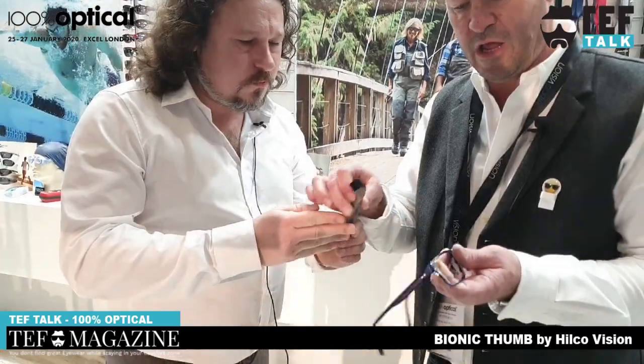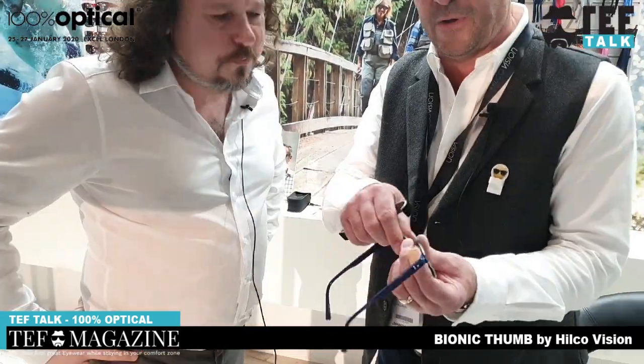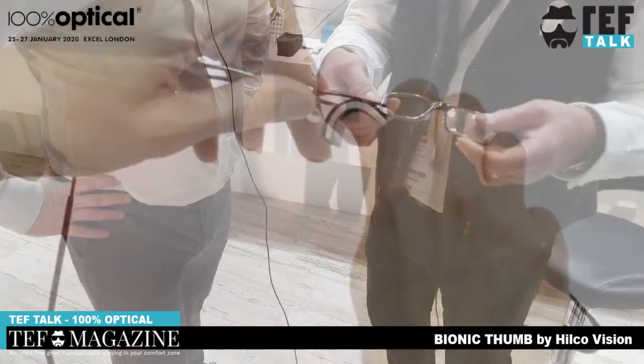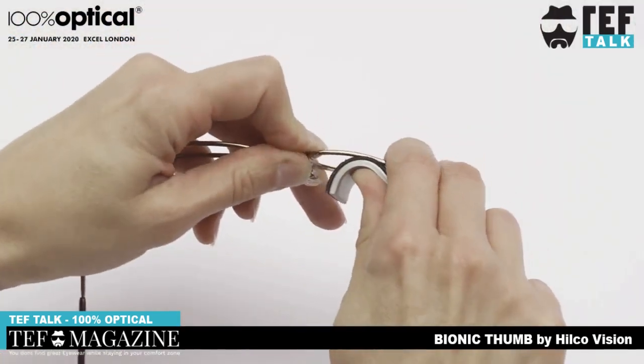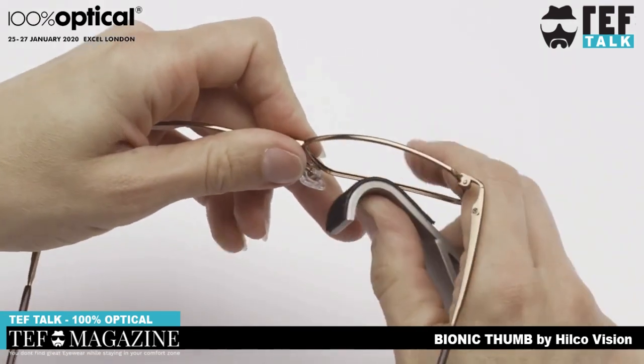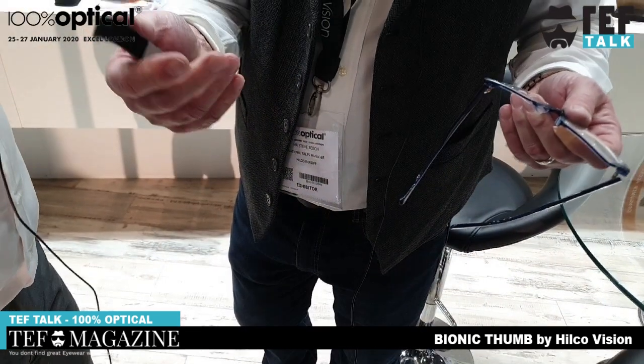The other thing you can do - you can heat the frame up and we can adjust the wrap of the frame. If you have a metal frame with a high plus lens, we're able to bow the rim. But it's a real neat product and we're bringing this out in different colors - pink coming up, gold, and black.